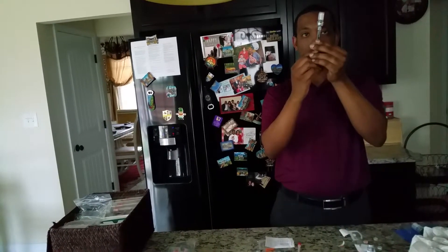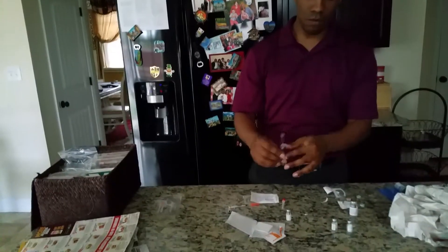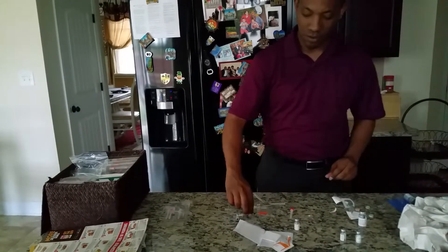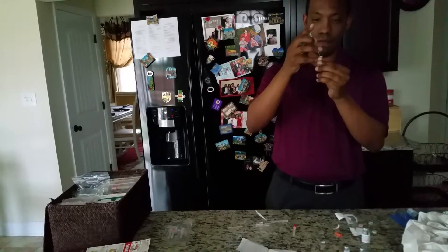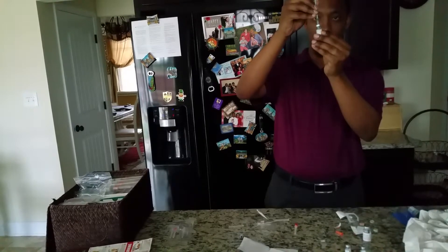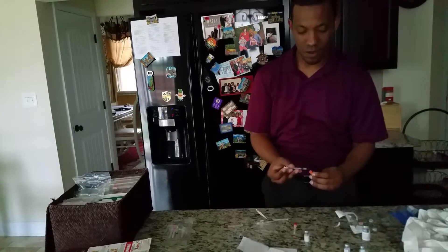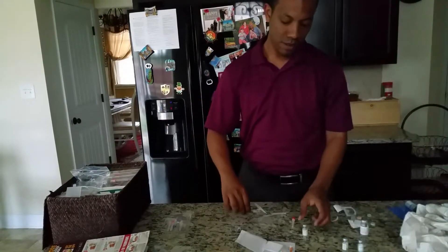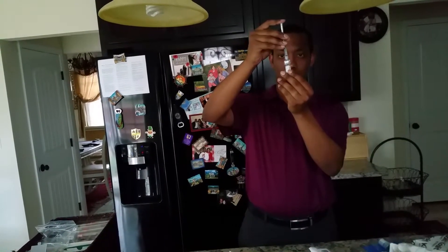So I'll move a little bit more. Two down, one more to go. Before I do the Q-cap thing with the saline mixture, I'm going to use the Menopur — I'm going to drop it right in. Put that Menopur back in there and we're done with this one. Cover that and drop it into the sharps container. Done with that. Q-cap into the last one.